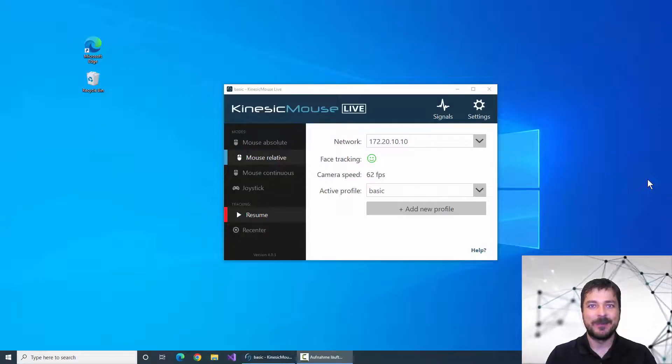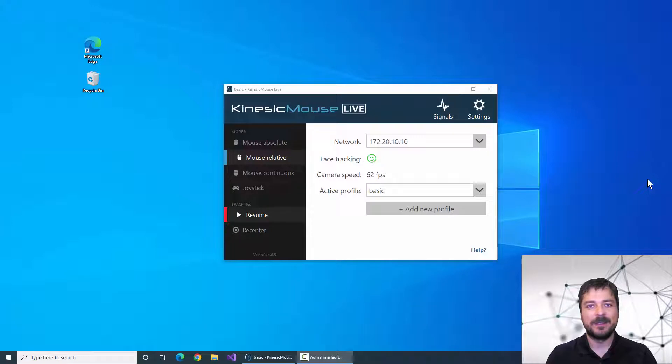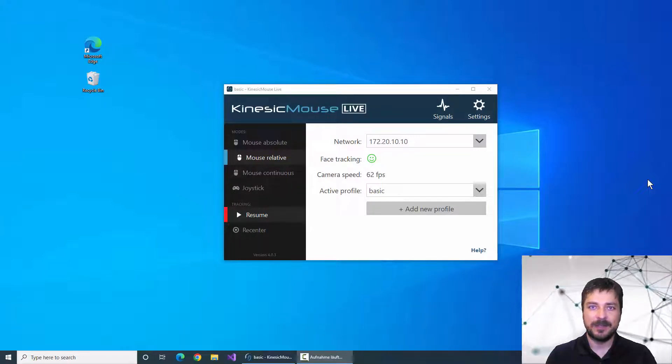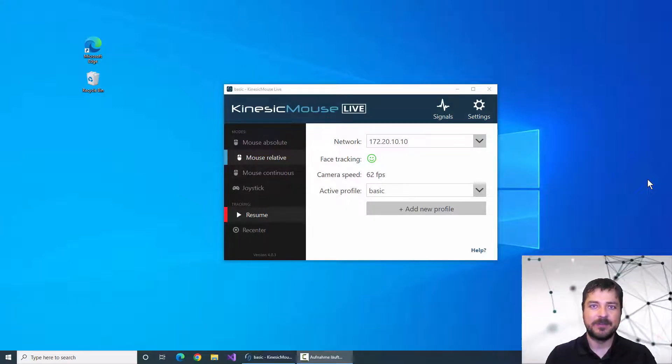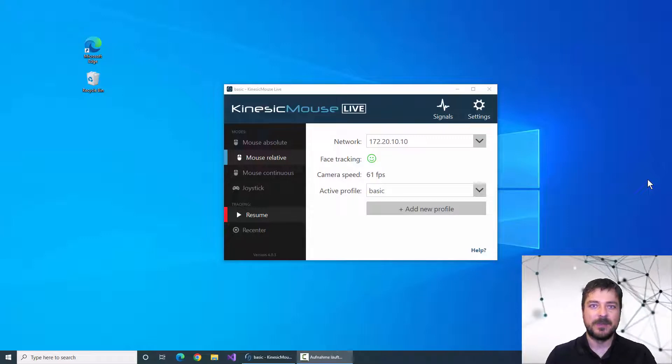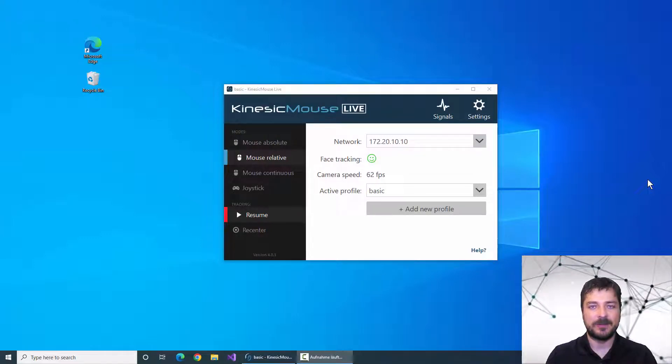Hello, welcome to this Kinesic Mouse Live tutorial video. In this video I'm going to talk about the click switch menu, which is a very easy solution to manage your mouse clicks in the Kinesic Mouse.